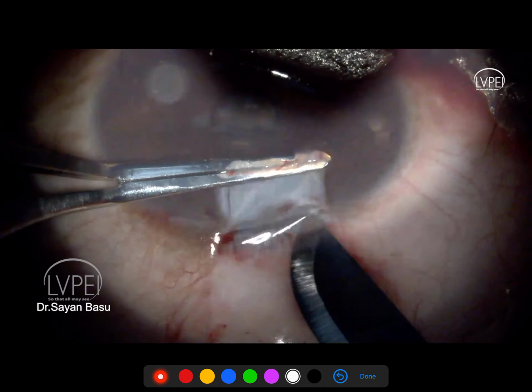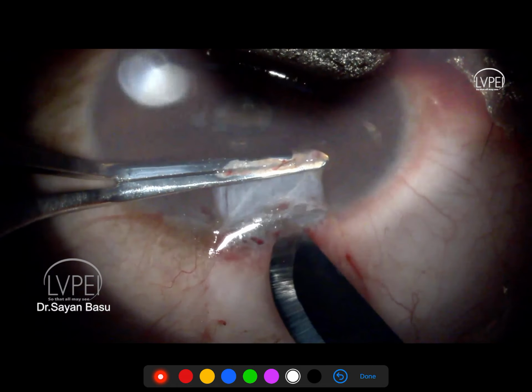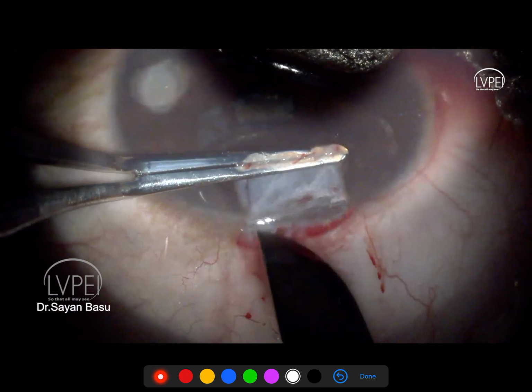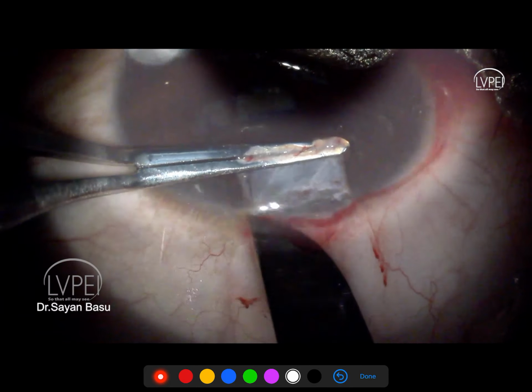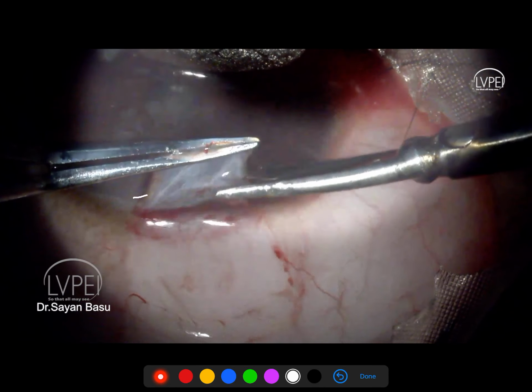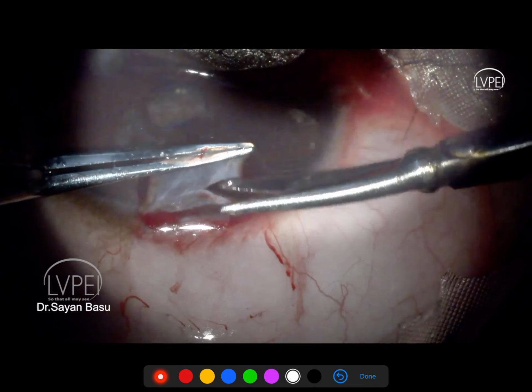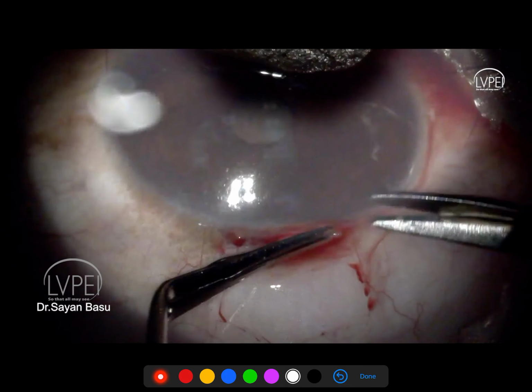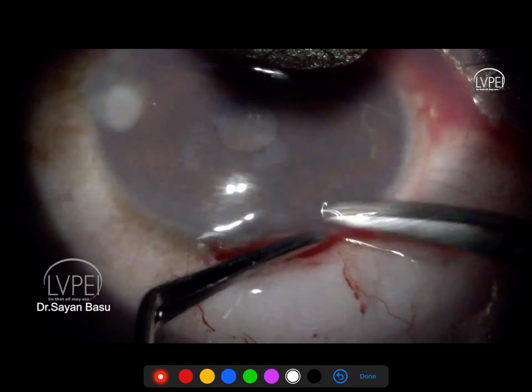That will always happen. So I am just releasing the edges now of this flap, so that when I am cutting the limbus off, I get the full dissected area. And now here I am going to cut through this part, so that I get only limbus in my tissue. So I have cut off the conjunctiva. I am going to discard this because in this particular case I am not going to do a conjunctival autograft.